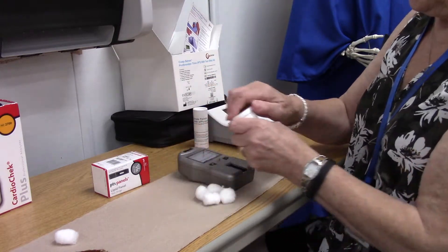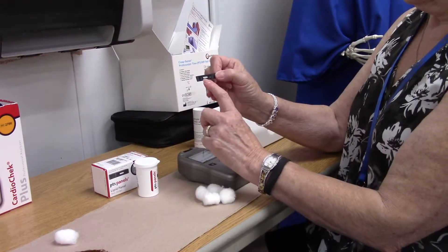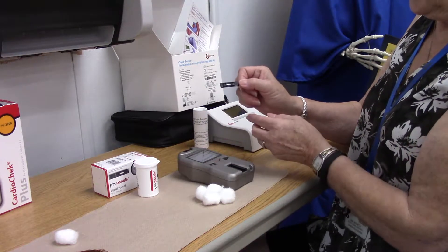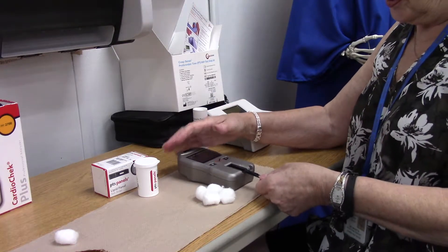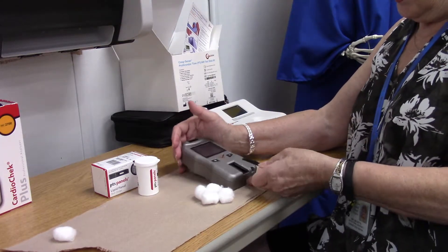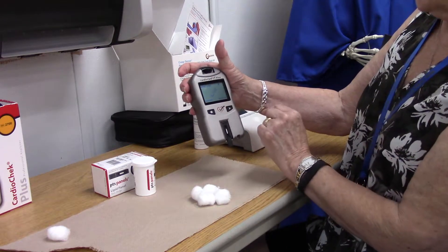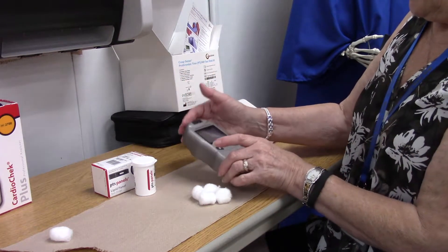Once the chip is in, it stays in until you switch test strips. The machine displays P907 and tells you to insert your strip, walking you through the process. Blood will need to fill the entire white area of the strip — if you don't have enough, you'll get an error. You hold the strip where it says PTS and slide it in. You'll see the red light, and once the strip is in, it tells you to apply your sample.